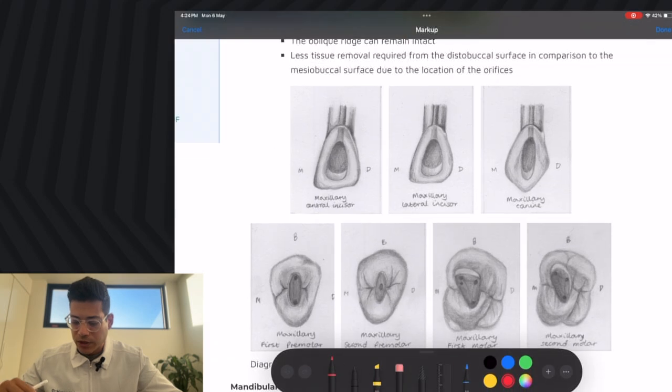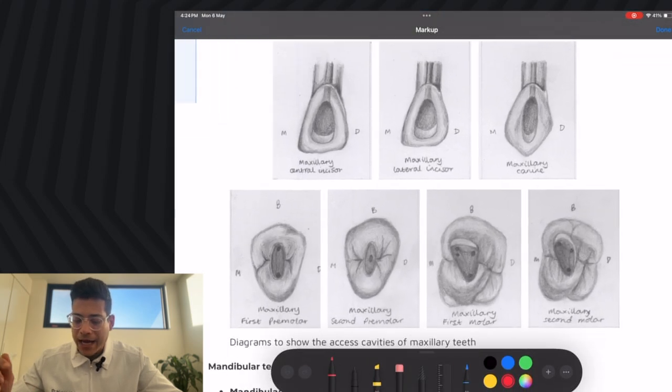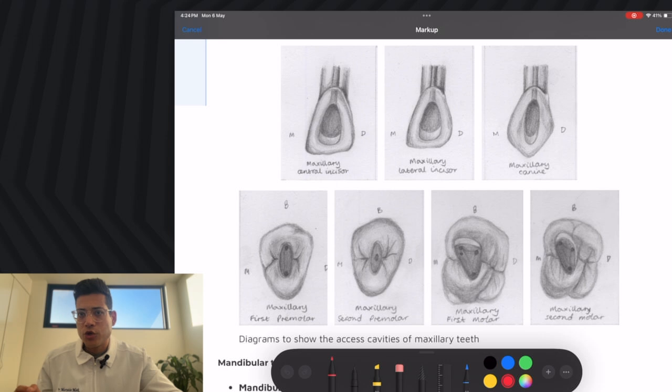Now, when we look into something like this, I genuinely believe with the upper tooth, you should be focusing on a similar pattern, which actually works well. However, at the same time, when you look from an occlusal view, you should see the canal orifices. And there's ways we predictably do that.